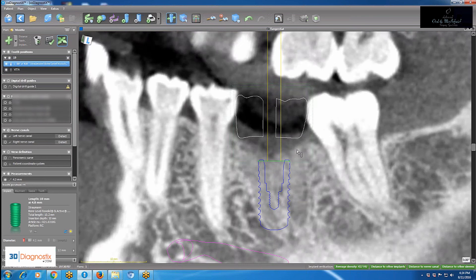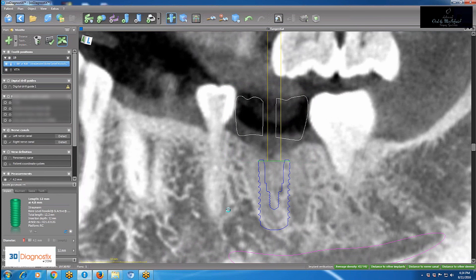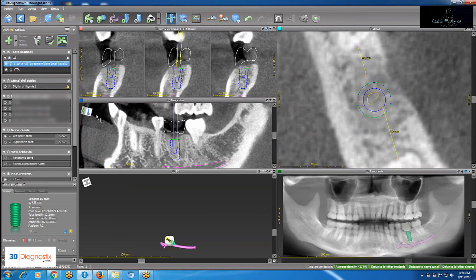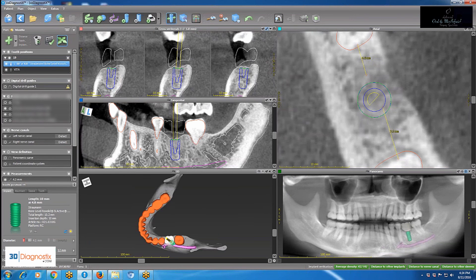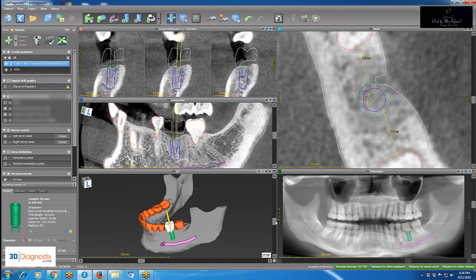If I try a longer implant — 4.8 by 12 — I get a warning at the bottom right that I'm too close to the nerve, so I go back to 4.8 by 10.